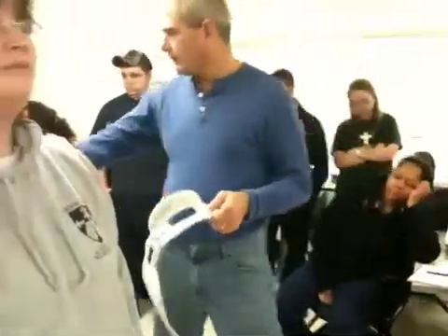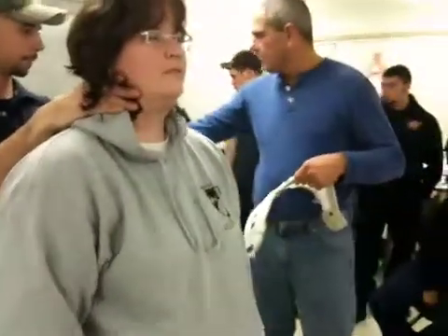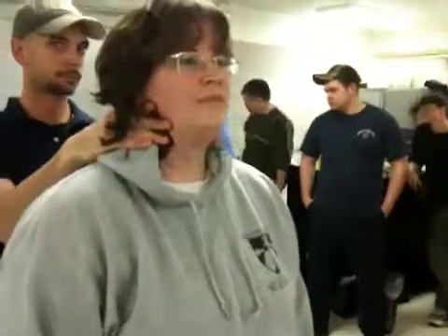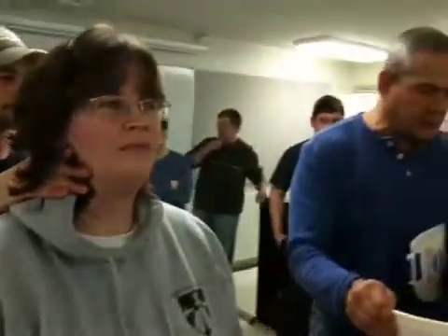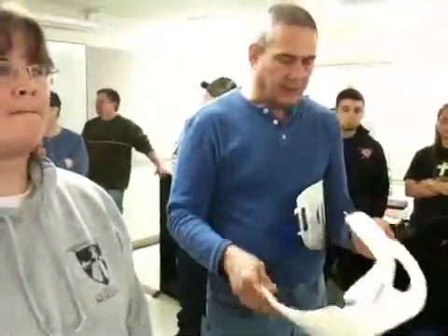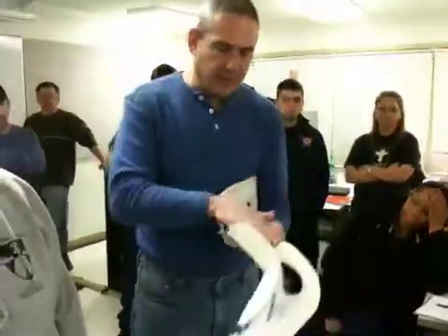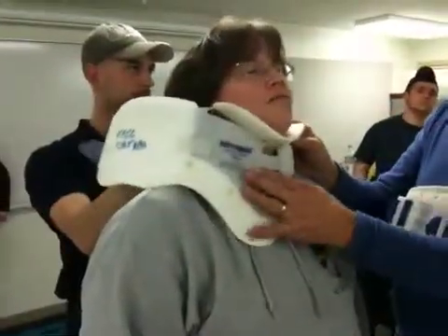Now there's another collar. It's just one piece. This one's not adjustable. So just be familiar with the different cervical collars. This one's going to be too big because it's going to put her head in an awkward position. There are advantages and disadvantages to both. This one you have to properly measure. This one is obviously too big. Look, it's going to push her chin up.